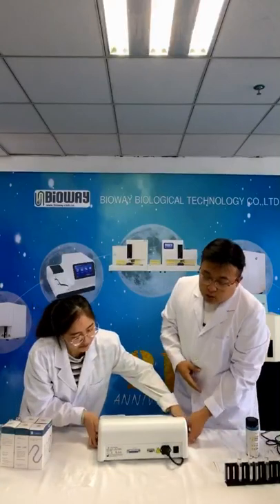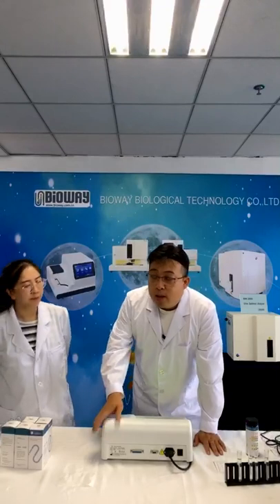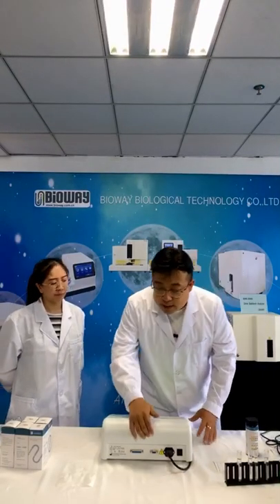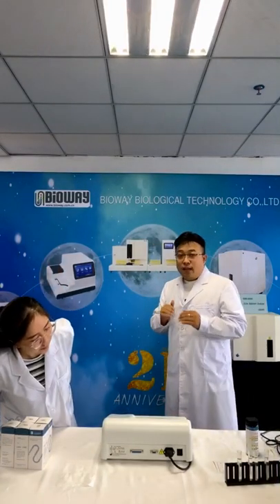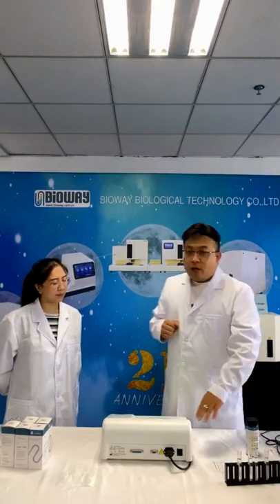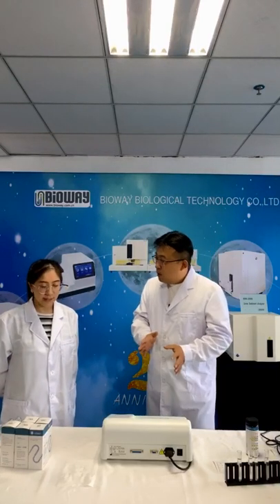These two parts, the computer part and the nine pin RS232 part. It can connect with the LIS and also can be connected with the PC. Actually speaking, this machine is more than 15 years old. It's a very old model, but on the other side, it is very stable. If not stable, it cannot last continuously for so many years.